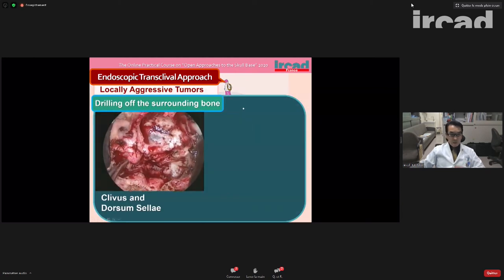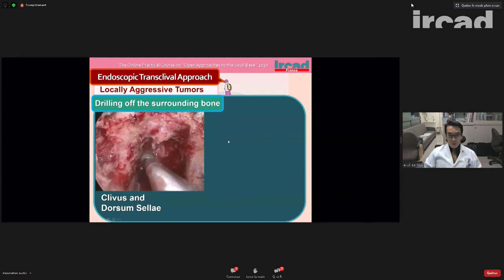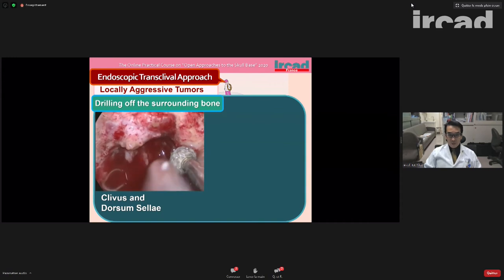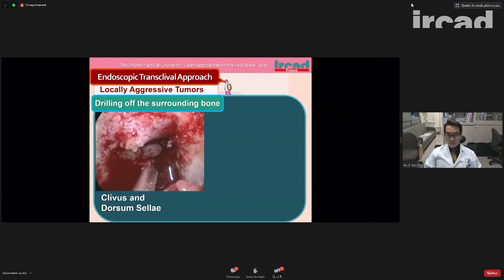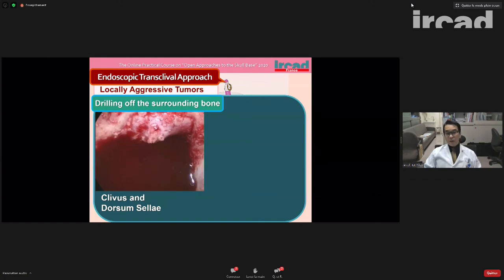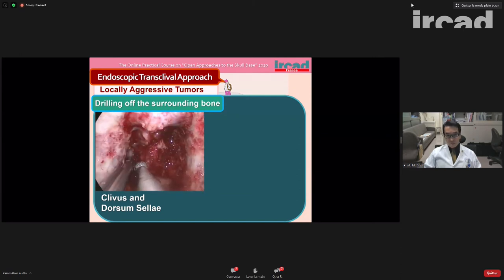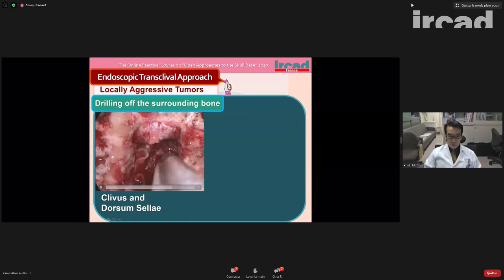And when we go into the clival recess, we should drill off not only the approach route, but we have to extensively remove the bony margin because the chordoma is always invading into the bony structure, and they always relapse from the bony margin. So we recommend to drill off all the clivus and also the dorsum sellae. When we remove the dorsum sellae, it often bleeds. There is massive bleeding from the venous plexus, but it's easily stopped with the gauze. So we can directly see the carotid prominence here, and drill off all the clivus and dorsum sellae bone.